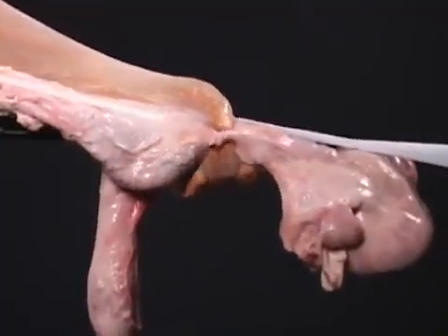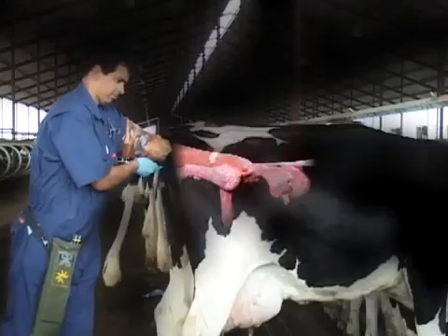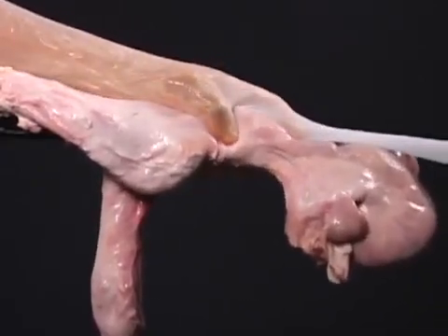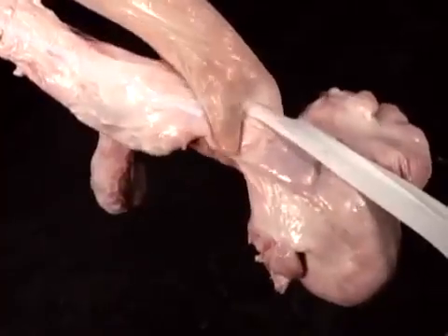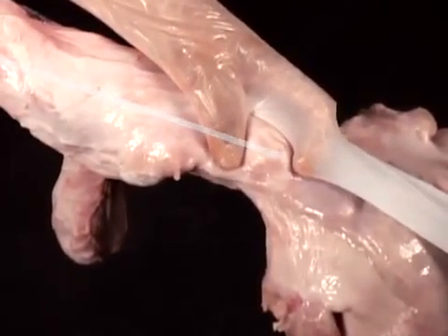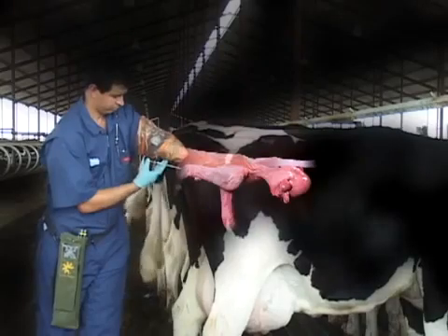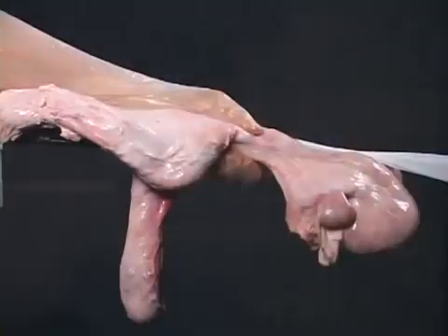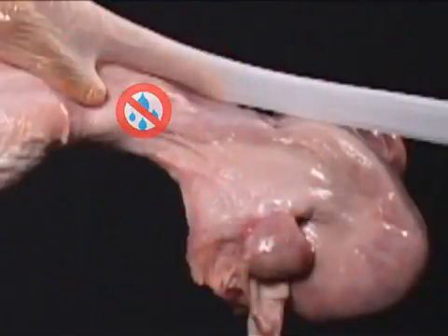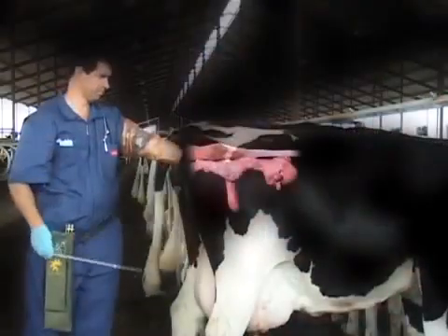The tip of the gun can be guided to the cervical canal by the fingers of the hand holding the cervix. Once the tip of the insemination gun is in the cervical canal, maintain slight forward pressure on the rod while manipulating the cervix ahead of the gun. While passing the AI gun through the cervix, keep your index finger at the end of the cervical canal so you can feel the tip of the gun at the target site. Lift your finger and slowly deposit the semen — this maximizes the amount and equal distribution of semen in the uterine body. Make sure you are on the target at all times. Depositing semen in the cervix or in the uterine horns may result in lower pregnancy rates and sometimes may cause damage to the uterus.